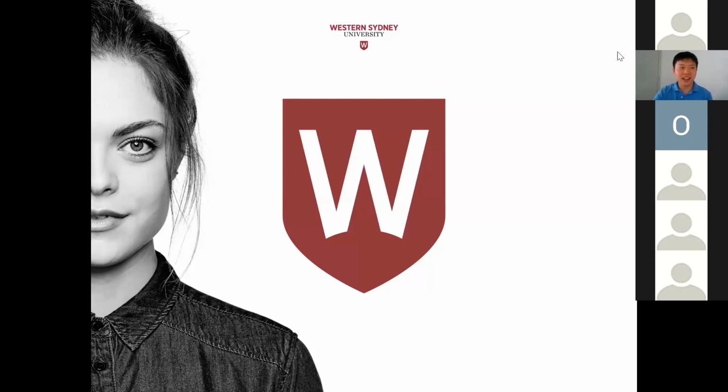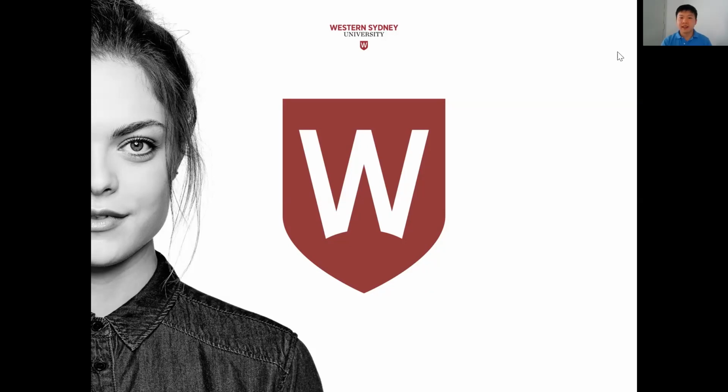Yep. Okay, hi everyone. So my name is Kenny. I'll be one of the tutors throughout the course these 2 years. Hopefully I'll get to meet every one of you and get to know all of you quite well throughout the course. I'll be going through with you all a very important and fundamental modality of cardiac investigation, which is the electrocardiogram or ECG. And I hope that every one of you has gone through and listened to Dr. Eshu's lecture, the Essentials Cardiac Electrophysiology lecture, because this tutorial will be an extension to that.